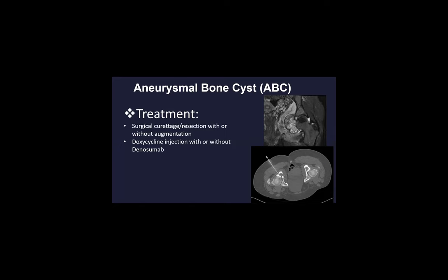That's why what we do is find an area as indicated there under CT guidance on the image below, drill through the bone, and inject in this area. We typically inject some contrast to make sure that there are no large draining vessels, because one of the concerns is when we inject doxycycline, which is mixed with some air and albumin to make a foam, that could embolize the lungs if there's a straight shot going in there. So after doing those, these patients respond pretty well, and they come back with healing in almost all the cases. And we have to go after all the small pockets.